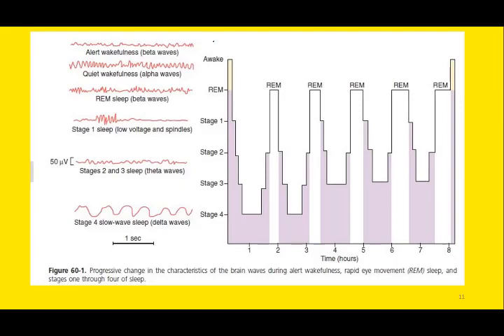So you can see this is the awake stage, then comes the rapid eye movement stage, followed by the non-REM stage. So these are the stages of non-REM: stage 1, 2, 3, and 4, the stages of non-REM. And different types of EEG bands are observed.